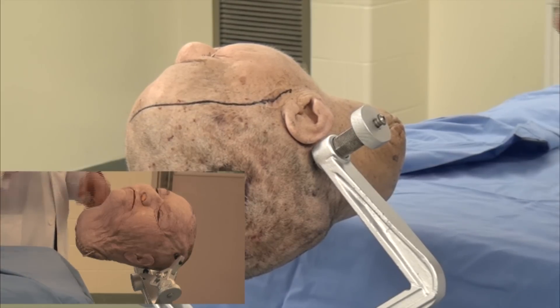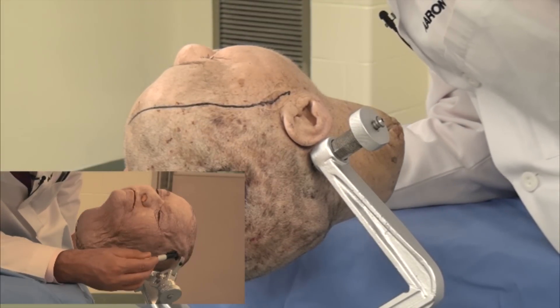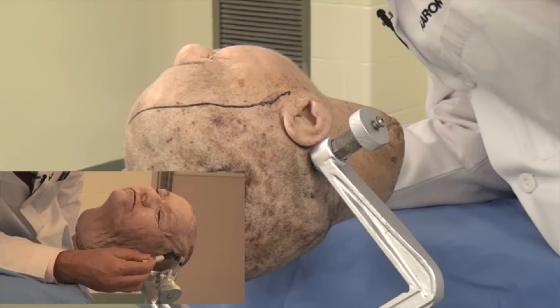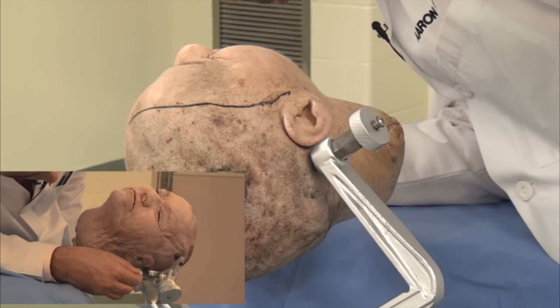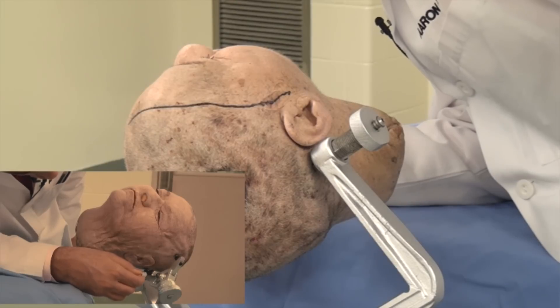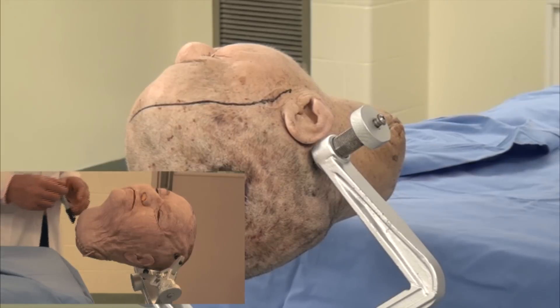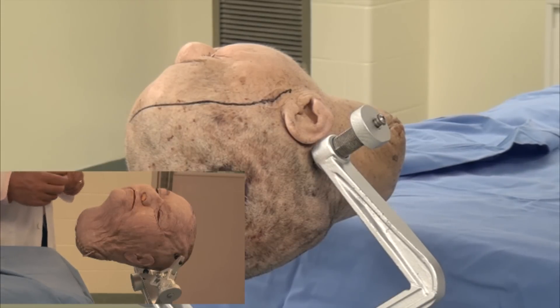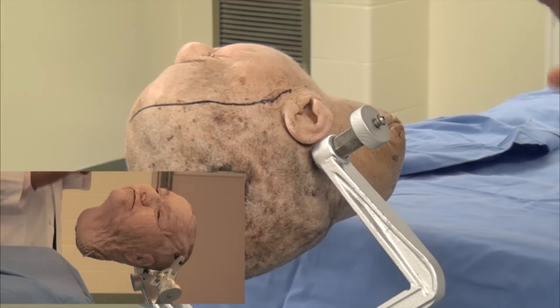The double pin is usually placed along the superior temporal line, with one of the pins outside the zone of the temporalis muscle and also posterior and superior to the tip of the ear. Both pins have good purchase in the bone, with your two pins being at the area.